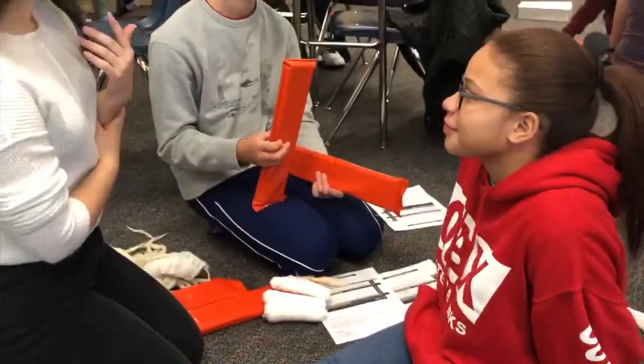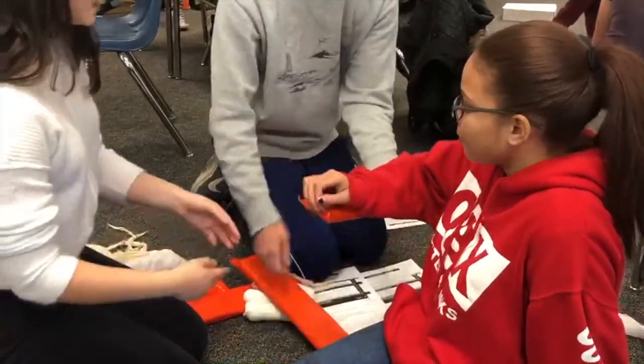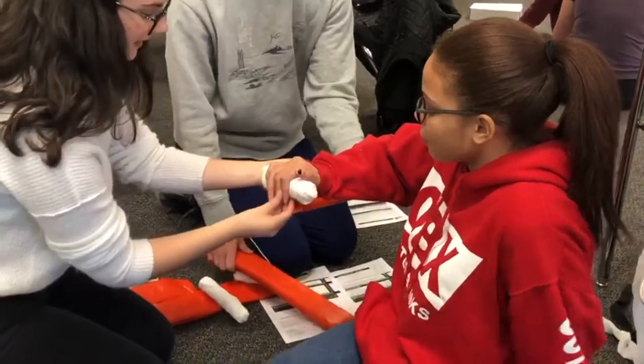Can you stabilize the patient with one board underneath? It's just going to be like that, and you're going to ask the patient to hold it like that.